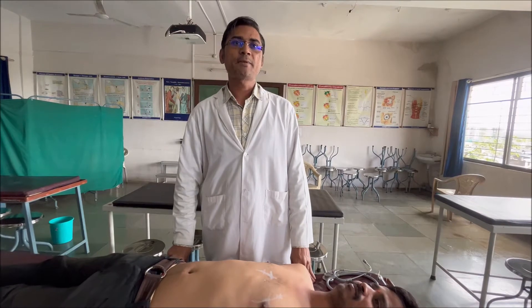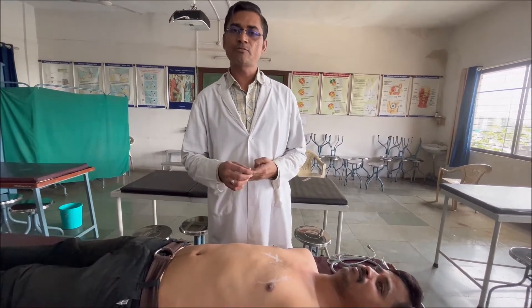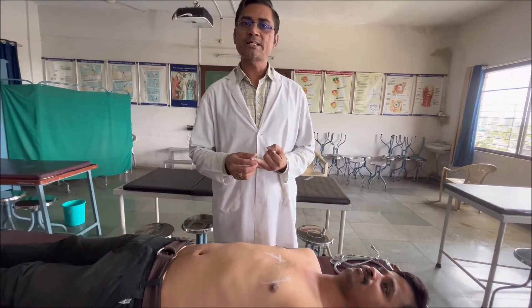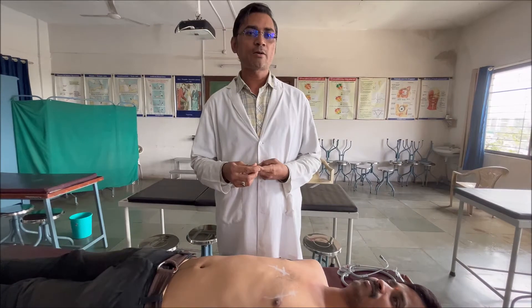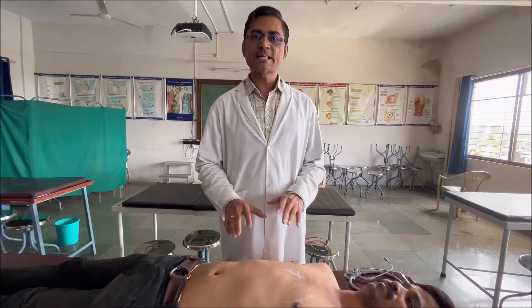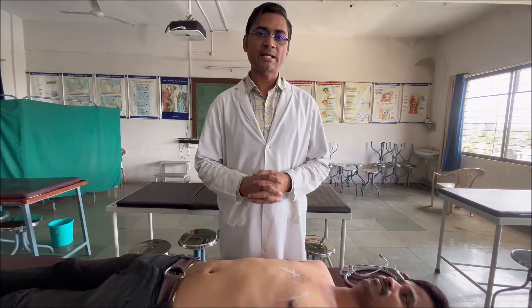Now we are moving to the last part in the clinical examination of the cardiovascular system, that is auscultation. In auscultation we are going to auscultate for the various heart sounds. There are mainly four heart sounds: first, second, third, and fourth heart sound. Among these four, only the first and second heart sound are audible with the stethoscope. The third and fourth heart sounds are not audible with the stethoscope; rather, they are audible with the phonocardiogram. So in this examination we are using the stethoscope for auscultation of only the first and second heart sound.